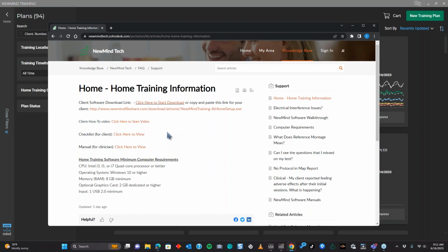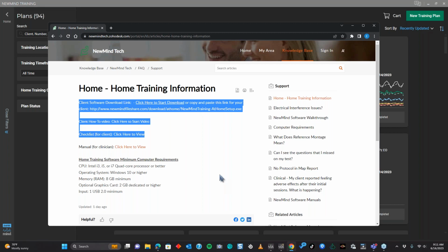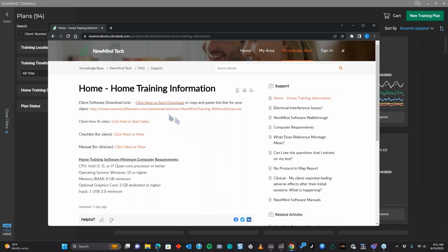What I recommend to clinics, when I'm training somebody on home training and the question comes up of, well, how do I get them going on this? One thing is sending them an email and including this information. So they're going to get the download link for the home training software, which is a free download for all your clients. There is this how-to video that walks them through.